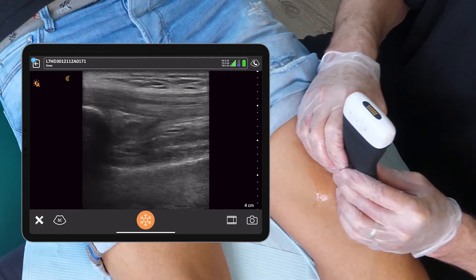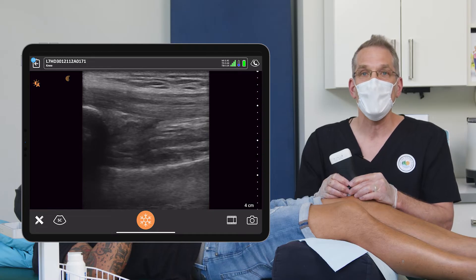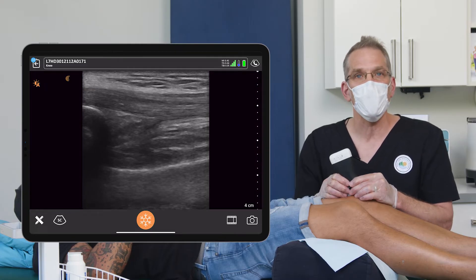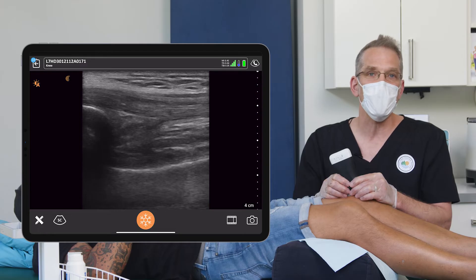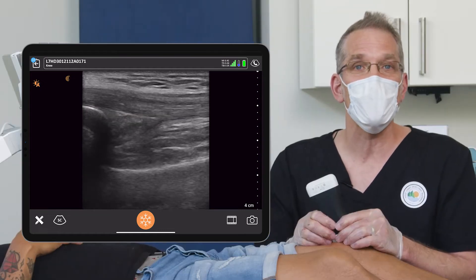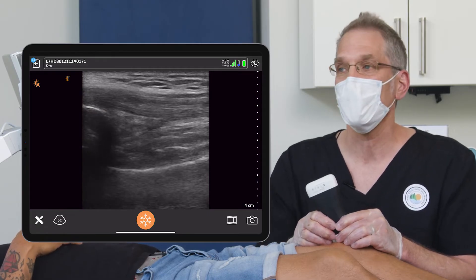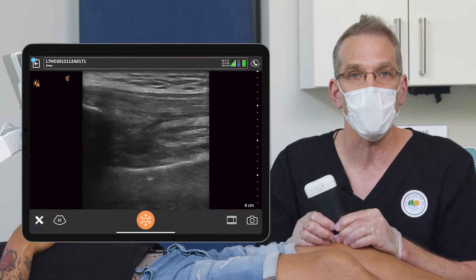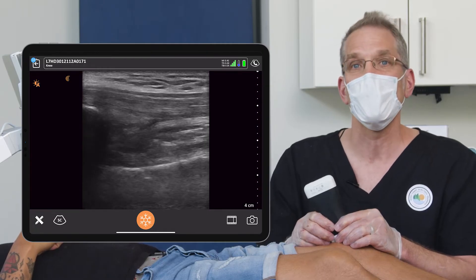Typically for an injection, it's not worthwhile removing any fluid unless there's more than 10 to 12 cc's. To aspirate a knee, you have to use a large bore needle — typically an 18-gauge needle — and there's inevitably some tissue injury when you do that aspiration, which causes bleeding. So one has to make a calculation: aspirating fluid reduces the volume into which you're putting medicine — it makes no sense to put a 3 cc injection into 100 cc's of fluid, as the medicine will be too diluted. But if there's too little fluid and you aspirate, you'll cause bleeding and local tissue irritation, ending up with more fluid in the form of blood inside the joint capsule, which often negates the value of aspiration.